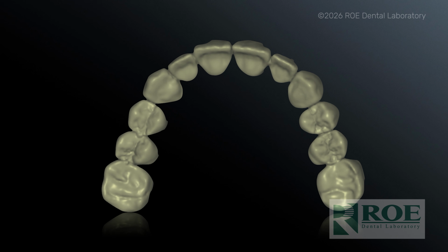So when he comes in, or she, we can then flip it out, put the new ones in, and let them heal in that prototype. So we get the benefit of both worlds, but without the stress of having him in the chair. So something to think about. There's a workflow for everybody. But the more you do these and the faster you get, you do them same day.